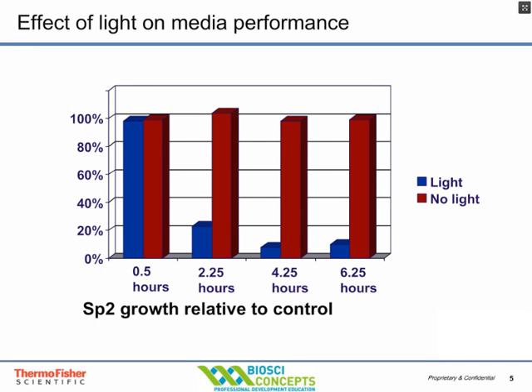Light will damage your media. In this experiment, cell culture media without phenol red was exposed to light for half an hour, two and a quarter, four and a quarter, or six and a quarter hours. You can see the spontaneous reduction in growth potential of the media using SP2 cells. Exposure to light will damage the growth potential of your media.